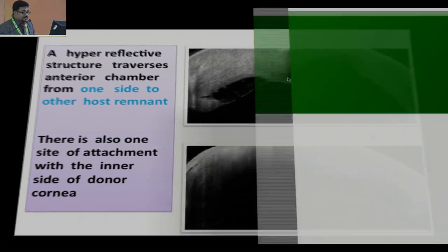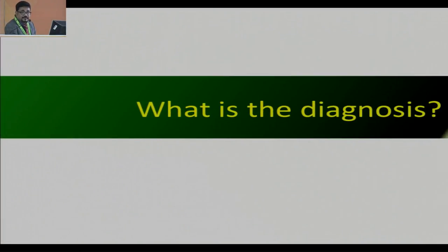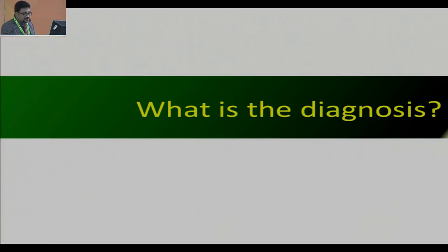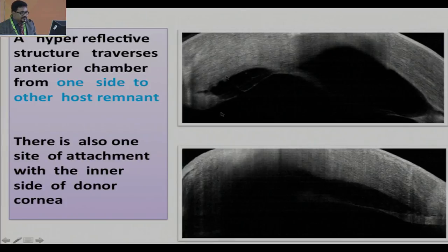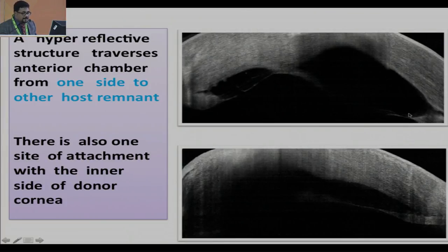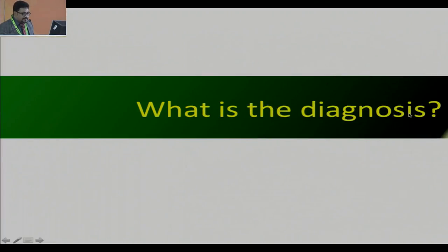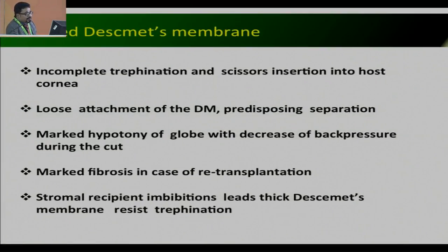What was the diagnosis in this case? The patient had an infiltrate in this area, and on ASOCT we can see this hyperreflective area. The diagnosis was retained Descemet's membrane, which can be due to incomplete removal or loose attachment of the Descemet's membrane. This patient again underwent repeat therapeutic keratoplasty, and we should remember that we have to remove the retained Descemet's membrane.